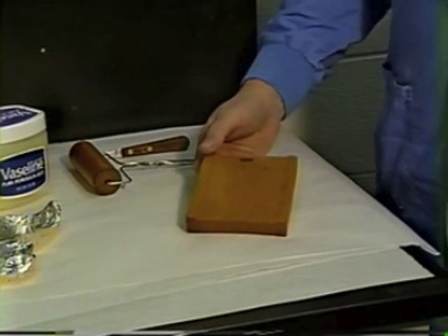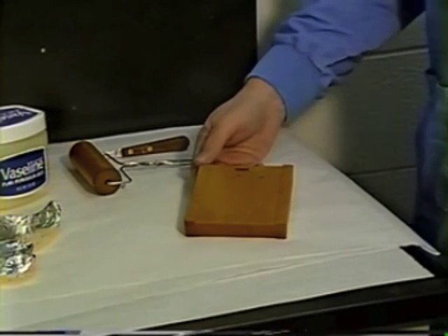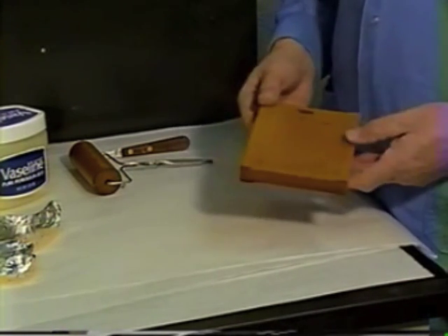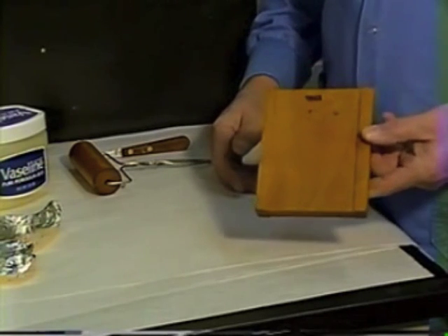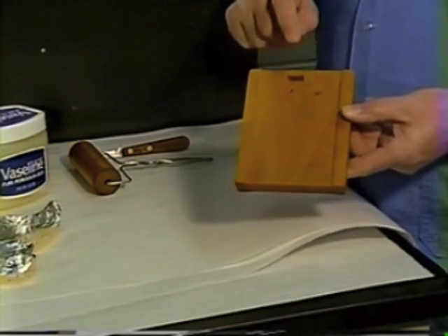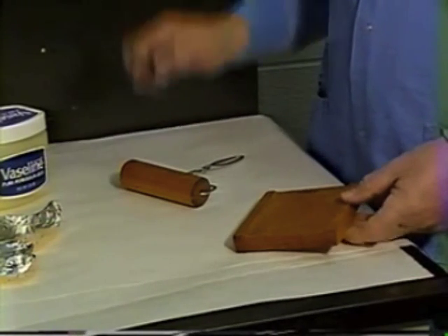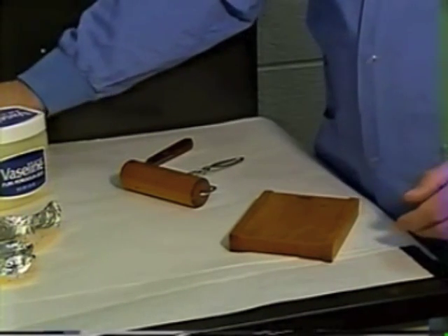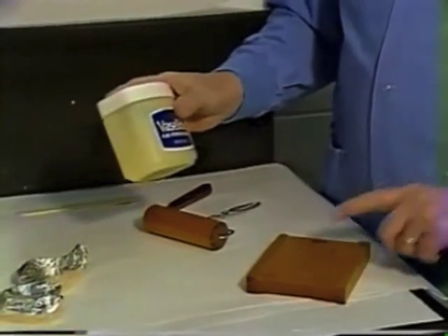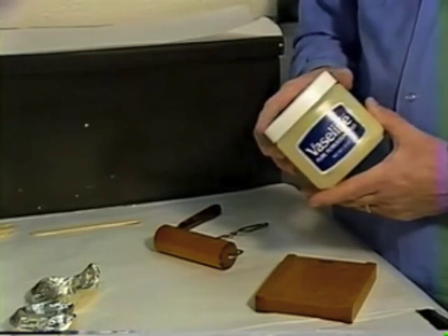Make sure that your equipment is all in order and that you have the right equipment, because you don't have time once you start mixing the material to stop and go back and hunt for it. You're going to need your roller board — for trays we use the thick side of the roller board. You're going to need the roller, a good knife, something to mix the material with like a tongue blade, and something to lubricate your roller and roller board — we usually use Vaseline for that.